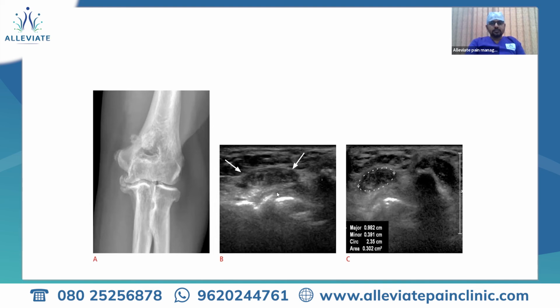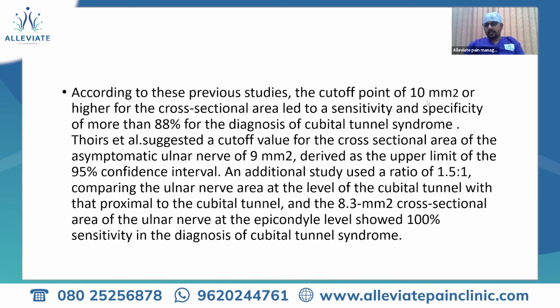Okay, so what about the cutoff value? Again, 10 mm squared is 88% sensitive and specific for the diagnosis of cubital tunnel syndrome. Okay, so yeah, that's about that.